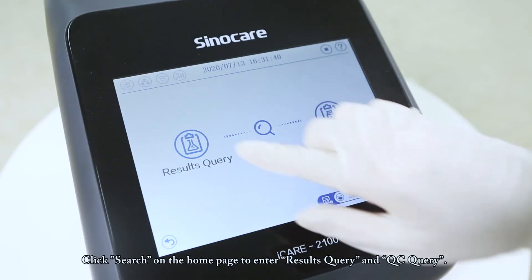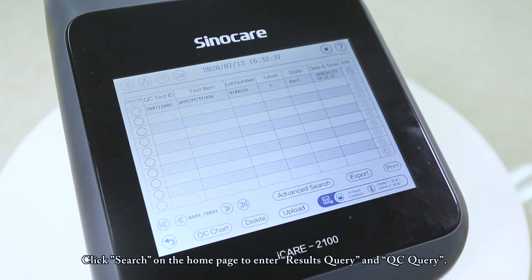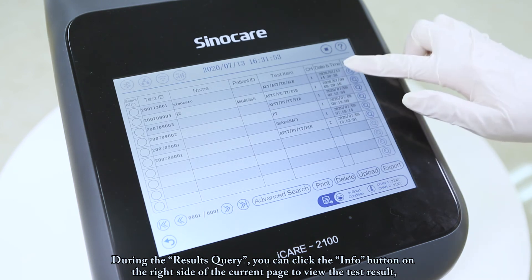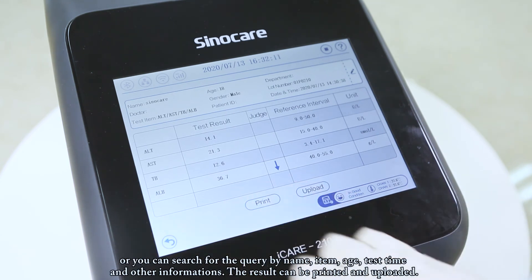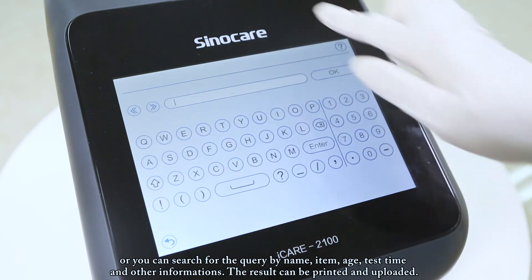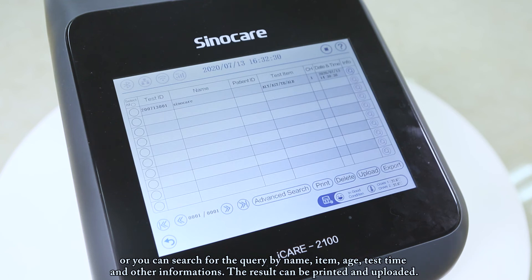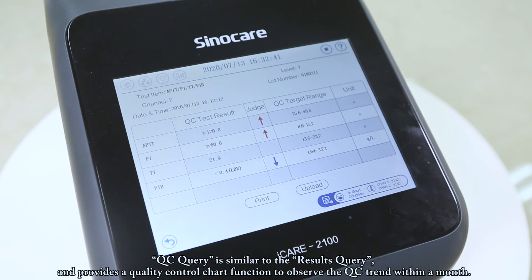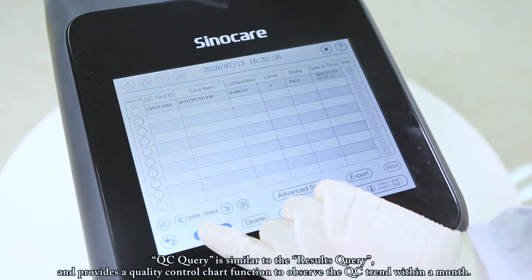Click Search on the home page to enter results query and QC query. During results query, click the Info button on the right side of the current page to view the test result, or search by name, item, age, test time, and other information. Results can be printed and uploaded. QC query is similar to results query and provides a quality control chart function to observe the QC trend within a month.